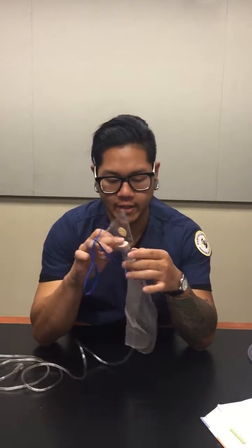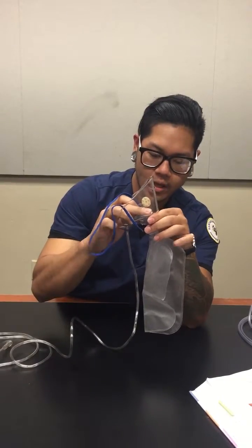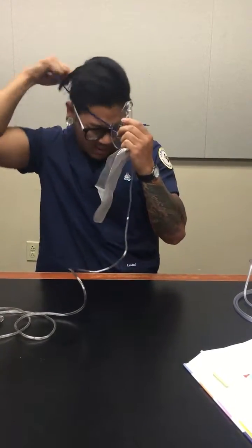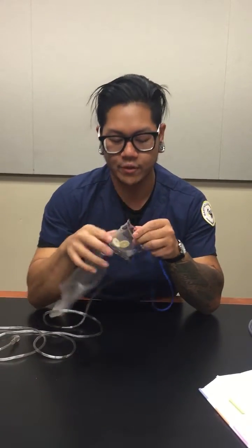So when you plug it into the machine and you have it at 10 liters per minute, you want to check and make sure that the bag is working. So you hold this, and it'll inflate the bag. Once the bag is inflated, then you can give it to the patient. So it goes on just like the simple mask. So it fits like that over your ears. Okay, well, I'm going to use the same one for your non-rebreather.